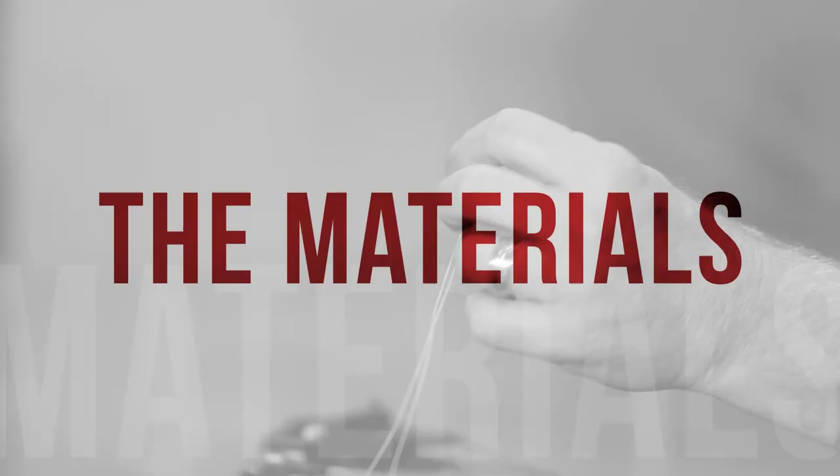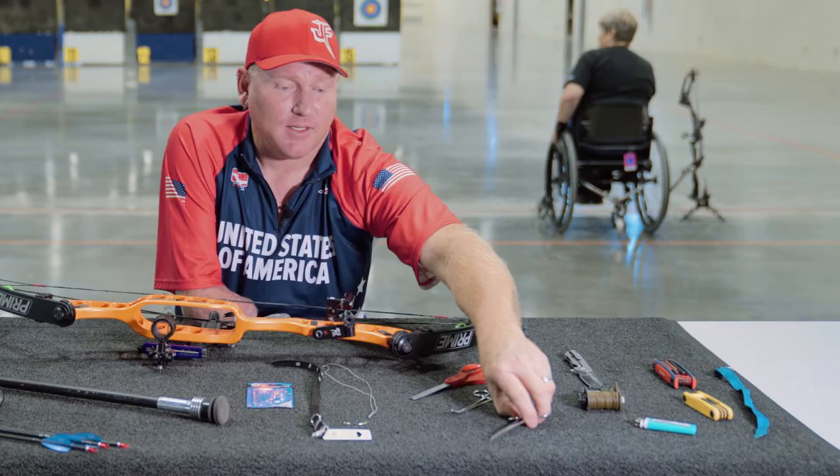I'm Jeff Fabry, four-time Paralympic archer for Team USA. What we're going to do here is build a mouth tab that I prefer to shoot. You're going to need a nylon dog leash and an upholstery needle. You'll also need clamps, scissors, and a lighter.